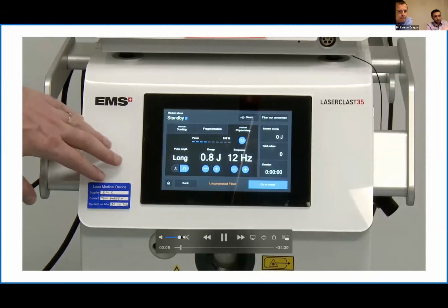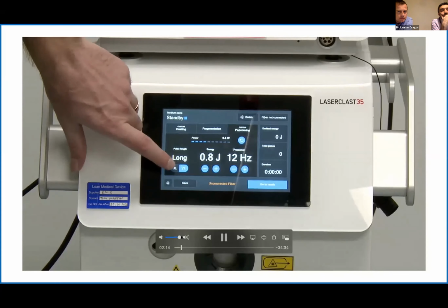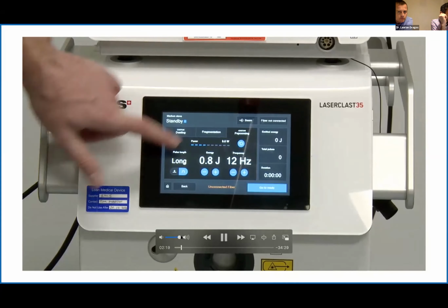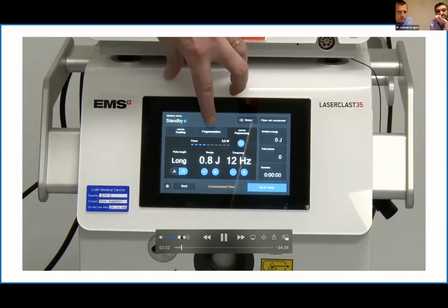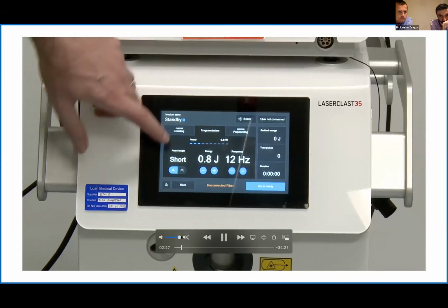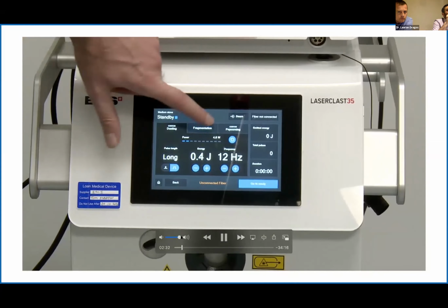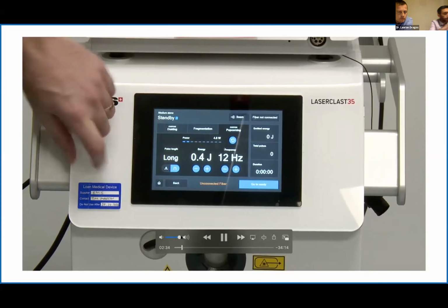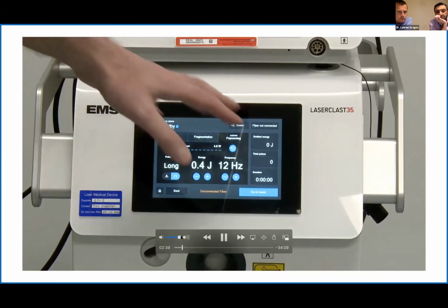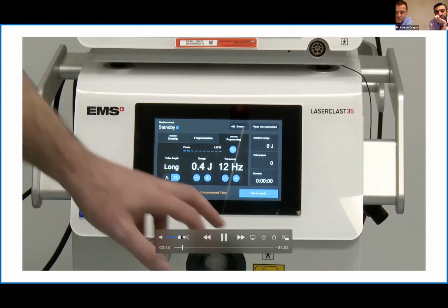What's very useful as well is that you can adjust the pulse from long pulse to short pulse. But as you know, the only time when you really need the short pulse is when you fragment. And as you can see, it's preset for short pulse. Again, dusting long pulse, fragmentation short pulse, popcorning long pulse. So you don't really have to know all these things. You just have to start with these settings and then adjust the machine according to your preference.